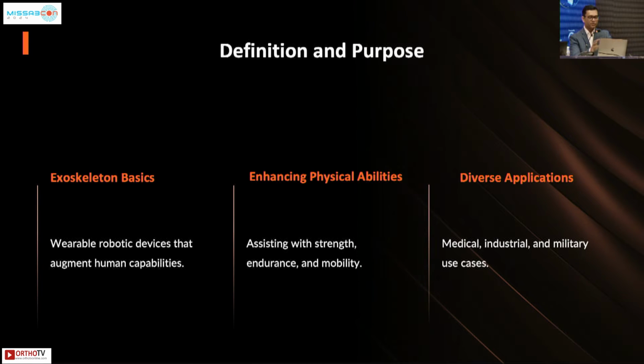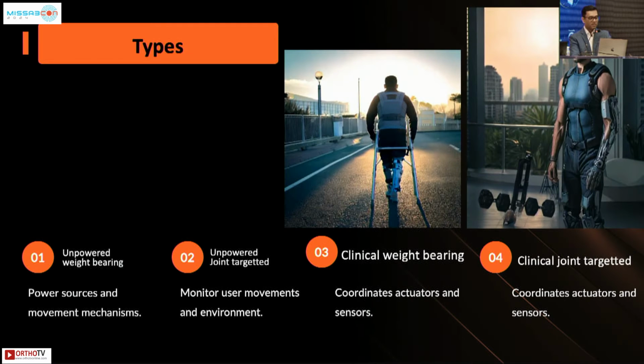It is something that you can wear, either powered or not powered. They have enhancing abilities with physical, and they have diverse applications. So there are different types.